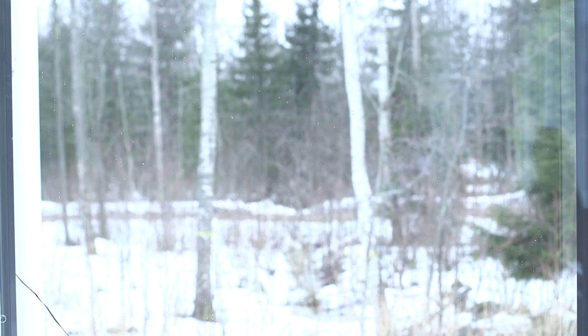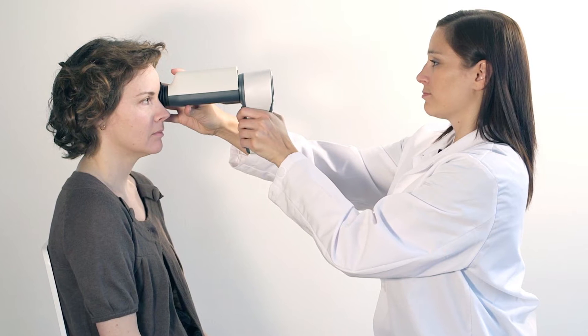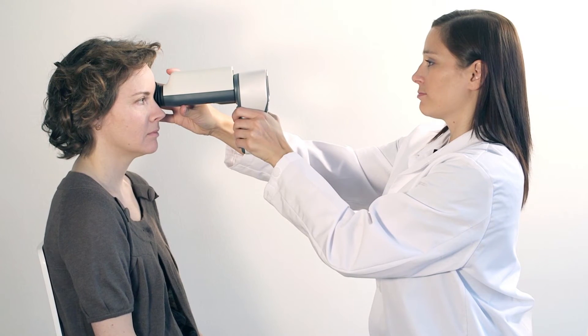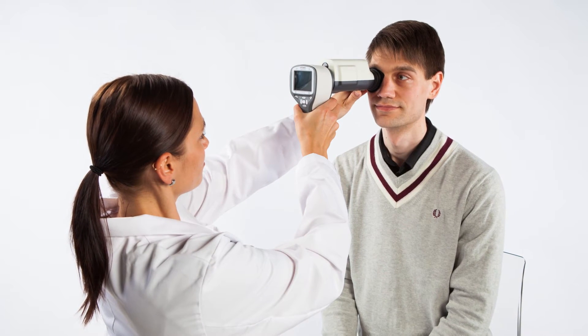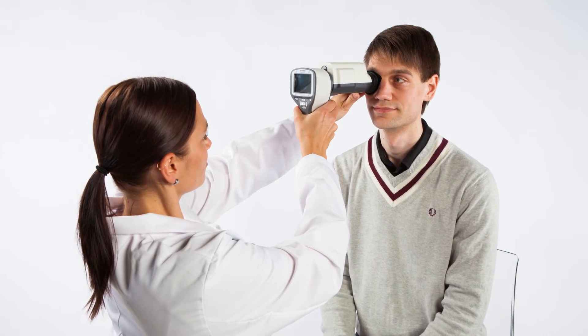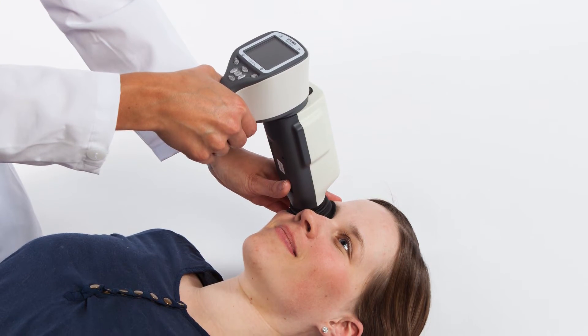Prepare for the examination by making the room as dark as possible — it is very important for capturing images easily. Proper technique, patient direction, and patient cooperation are the keys to getting the best possible images. To ensure the camera is stable for the image, it is recommended that both patient and examiner are seated during the examination. It is also possible to use the camera for patients lying down.